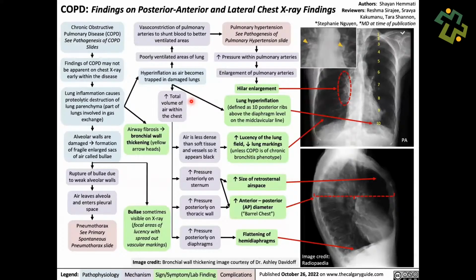Okay, and so we can get into pathology of some conditions on the X-ray, and probably none of this typifies it more than COPD, which is chronic obstructive lung disease. And this is an example of how we're going to go into it, looking at the features, right? So obviously with COPD, you have hypoxemia, you have shunting of blood, and you have pulmonary hypertension. So this is one of the signs of pulmonary hypertension with hilar enlargement. Hyperinflation, what does that mean? More than 7 anterior ribs, more than 10 posterior ribs. That's hyperinflation. Look at that.